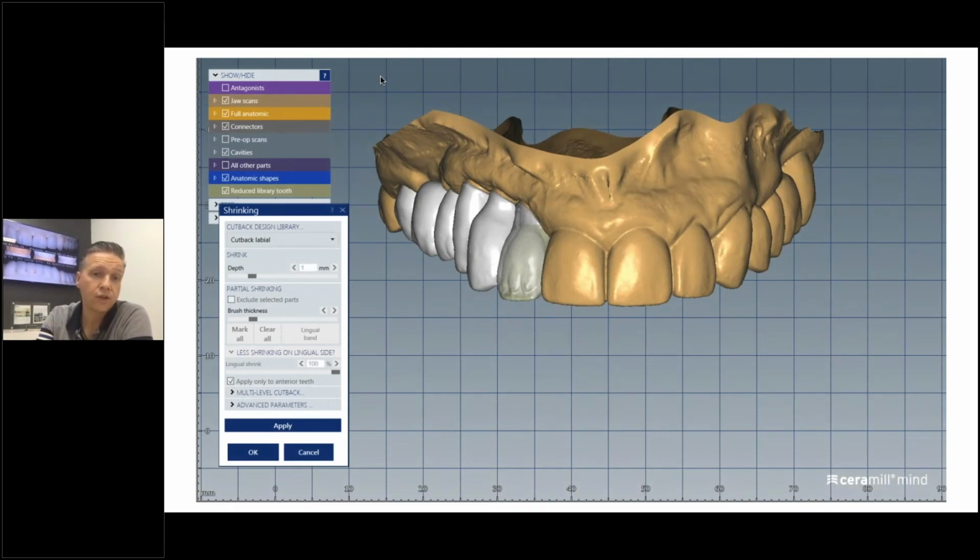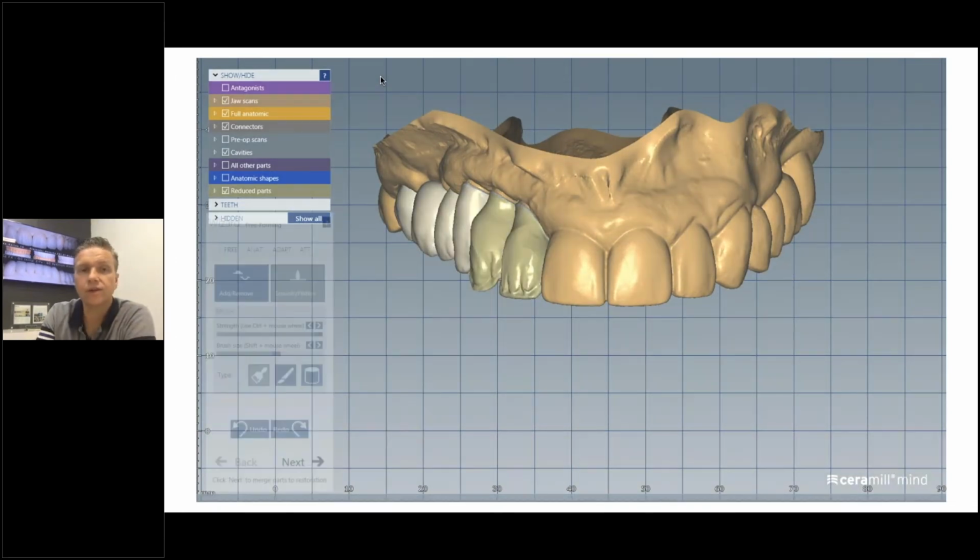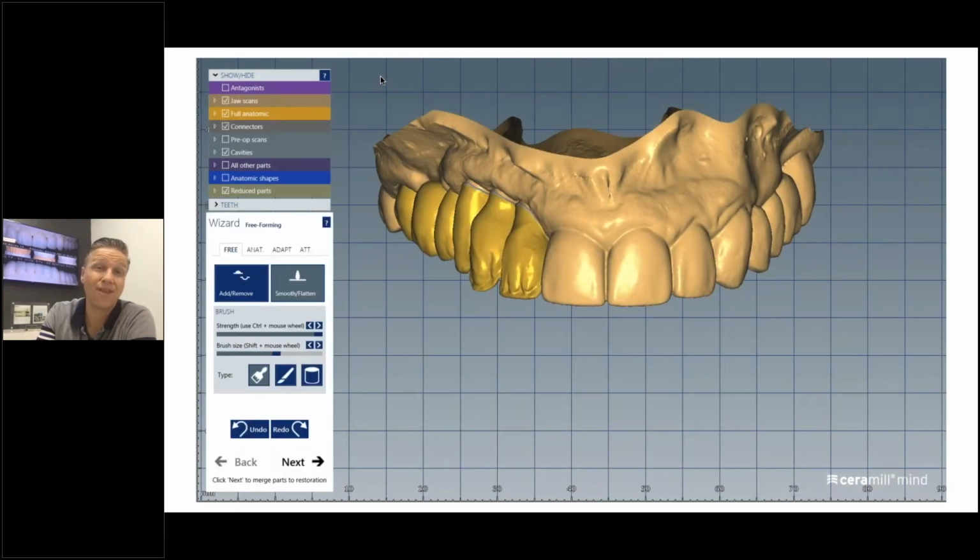I'm usually choosing the cutback in the library. That also is very economic because I can then characterize with some glaze, internal stain, mamelons, and I can use less porcelain. I do that here on the lateral, and in that case also on the canine. You see the same cutback, but it's a minimal cutback. So I do not usually layer a lot of thick porcelain on zirconia. I try to avoid that.